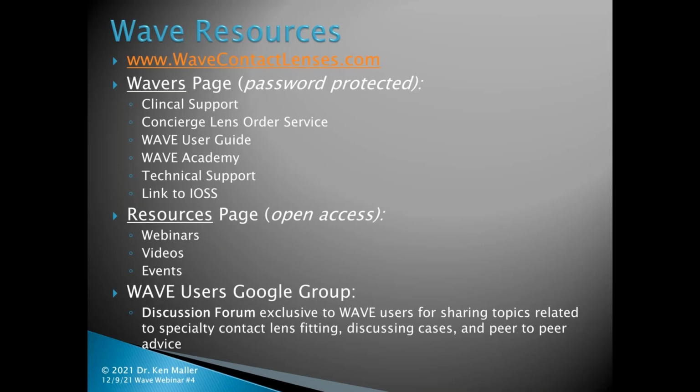The first case was a multifocal for that established wearer, and she was absolutely delighted with her mid-range and near vision. I may have had to tweak things just a little bit from the lens I ended up showing here in the webinar, but whatever tweaks I had to do, they were very minor. That makes total sense. Just kind of walking us through your initial design process and then making changes later based on what you see in the slit lamp.